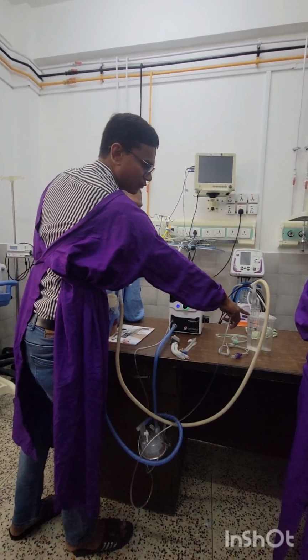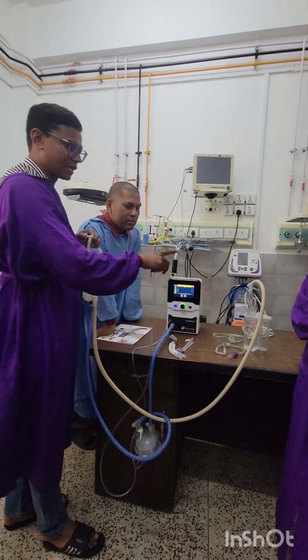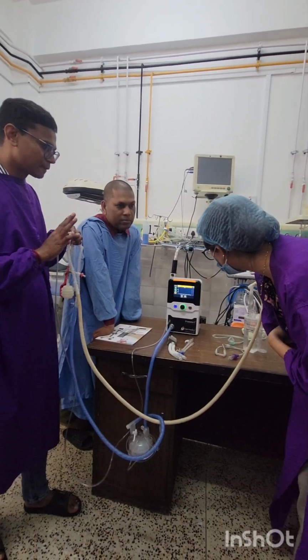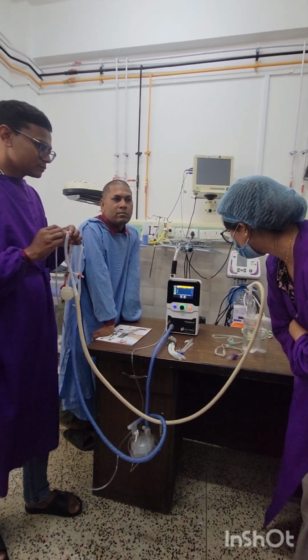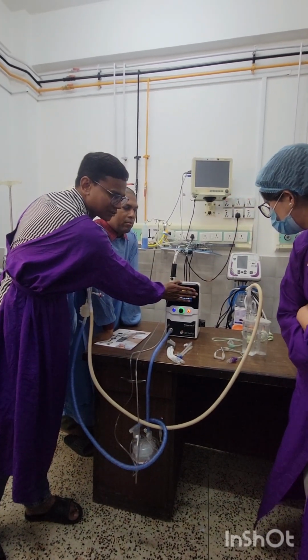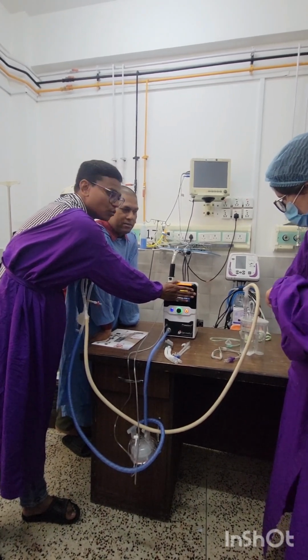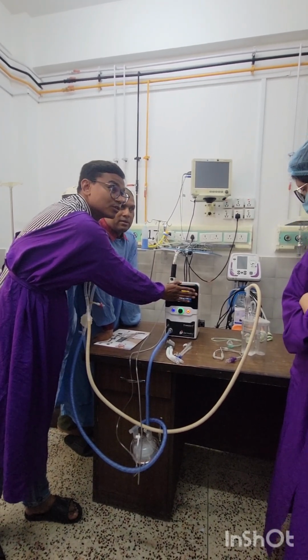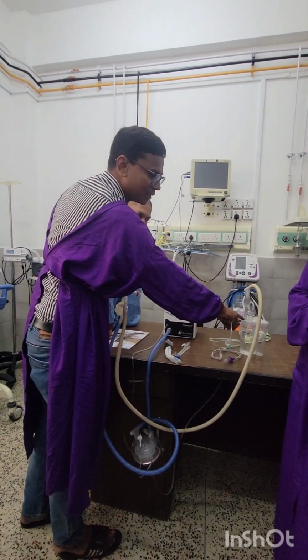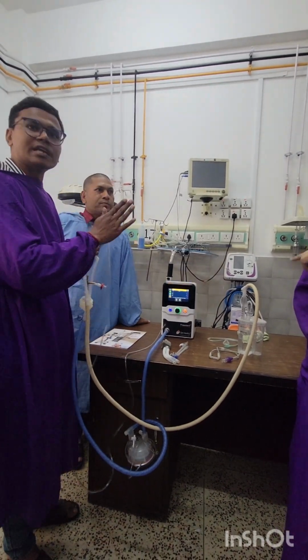Now you can check that the 5 cm H2O pressure is delivering, right? Can anybody say how much pressure is going to the baby right now? The CPAP pressure. We don't have an indication right now in the device. Just forget about this screen. Now can you say how much pressure is going to the baby? 5 cm H2O? How much? According to the company protocols, whatever the number is outside, you take that as the pressure delivered to the baby. But here, this is the indication.